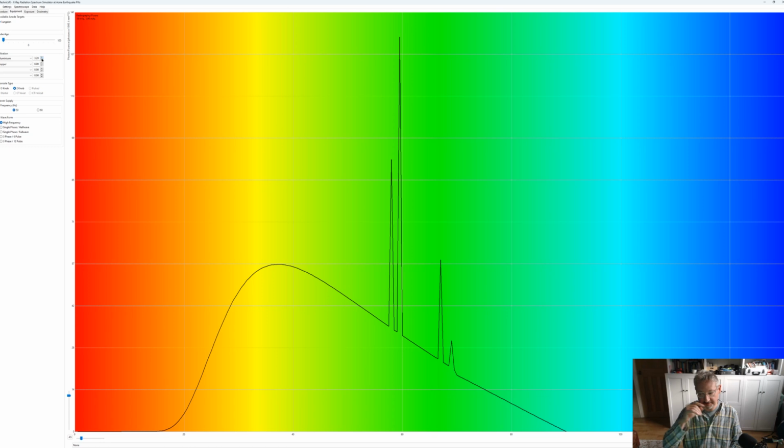Even though it's made of beryllium, it still filters some. And then of course there's the tungsten. A lot of the X-ray photons are actually generated within the tungsten of the anode, and so they have filtration as they're coming out of the tungsten. So for all those reasons, inherent filtration exists. So we lose a lot of energy here, and then we're starting to get the energy as a peak.